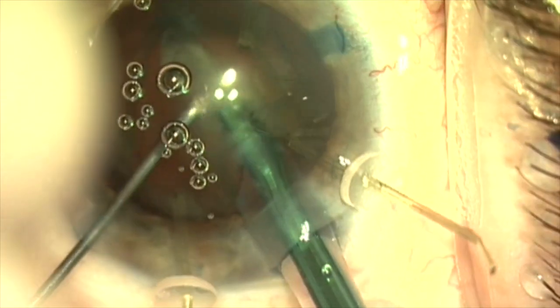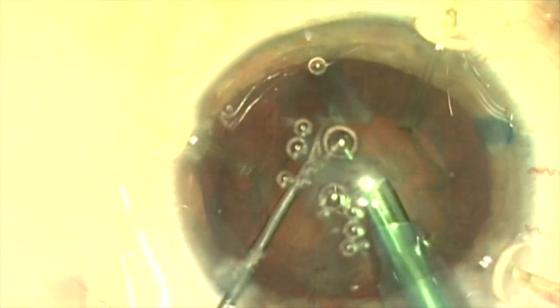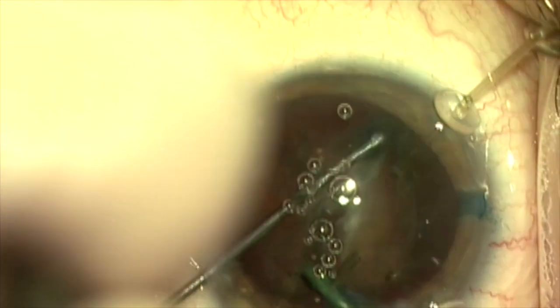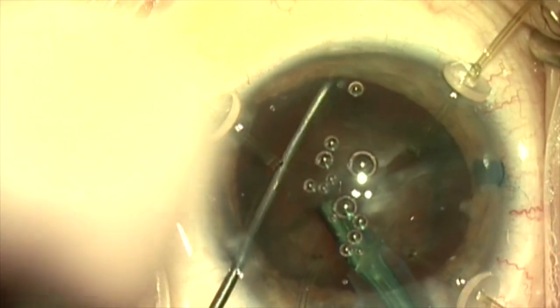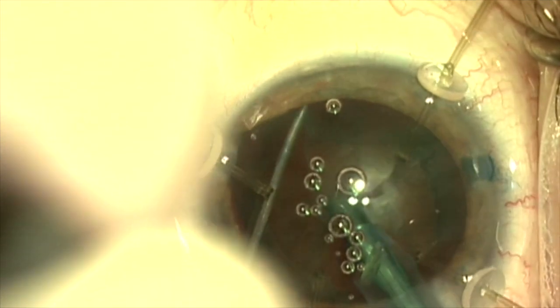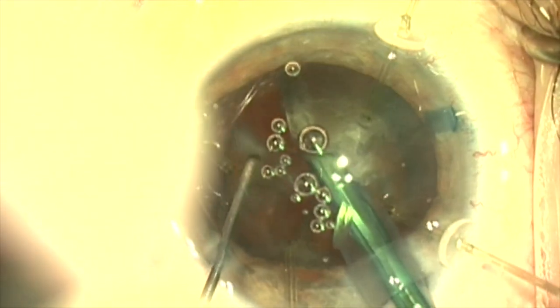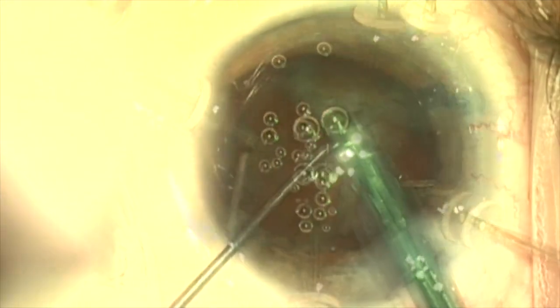Now we're going to do our normal chopping technique for this cataract — about a 2-3-plus nuclear sclerosis. We're going to do our routine horizontal chopping technique. The lens rotates well. We've hydro-dissected, and the capsule retractors are supporting the capsule bag in lieu of zonules.